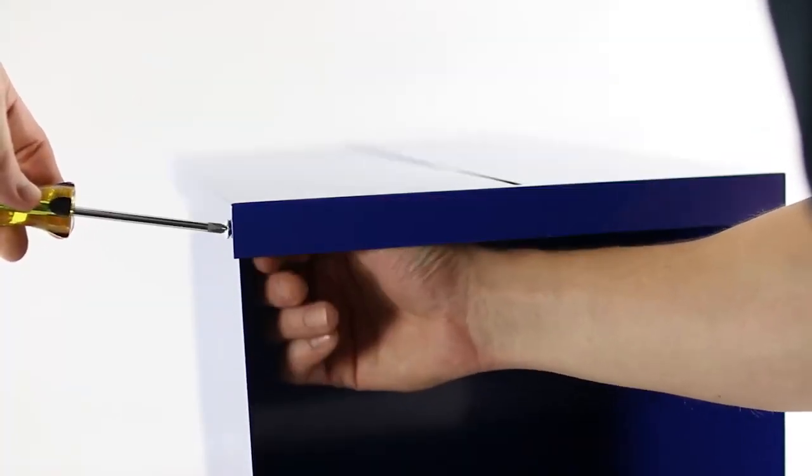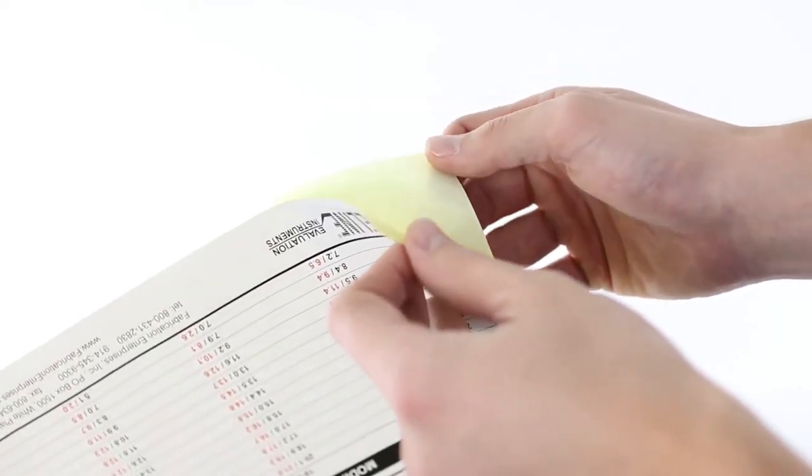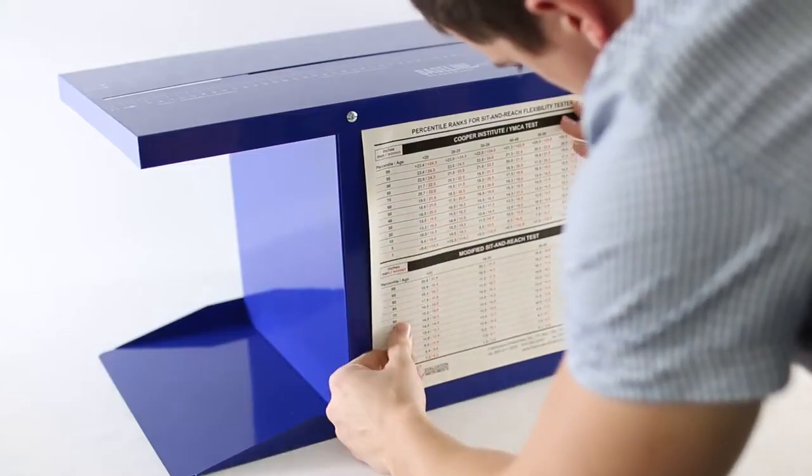A screwdriver may be needed to anchor the screw while tightening the wing nuts. Remove the backing from the self-adhesive chart and adhere it to a side of the box so that it is easily read.